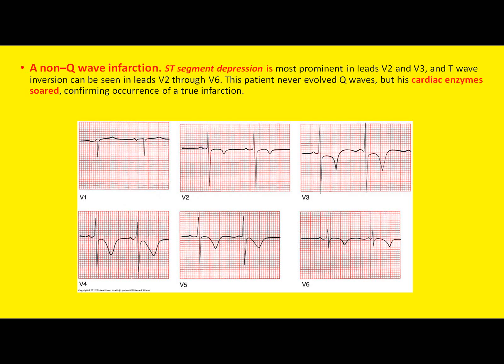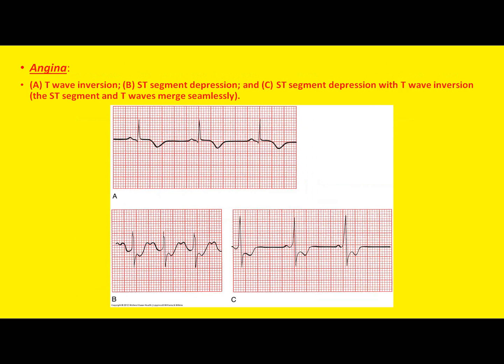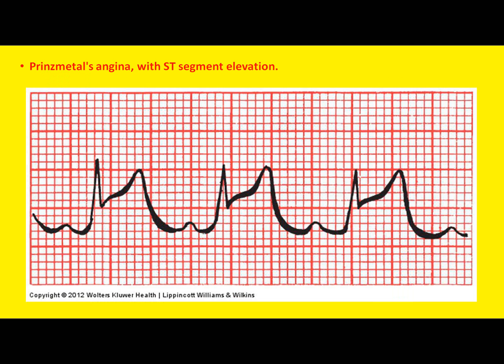And usually with a heart attack or angina, you see the T inversion is very symmetrical, a perfect V-shape. That's one of the things you can look for. And the T wave inversion again here. Angina causes the same symptoms. You see it with the ST depression. ST depression can be due to poor blood supply. And these will come back to normal. Sometimes you give them oxygen and things like that. But these patients have to be admitted because that means they have a heart problem.